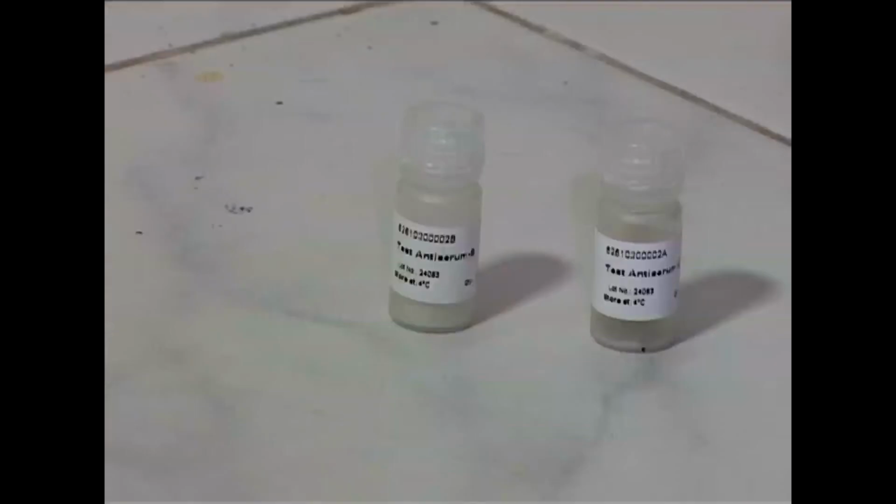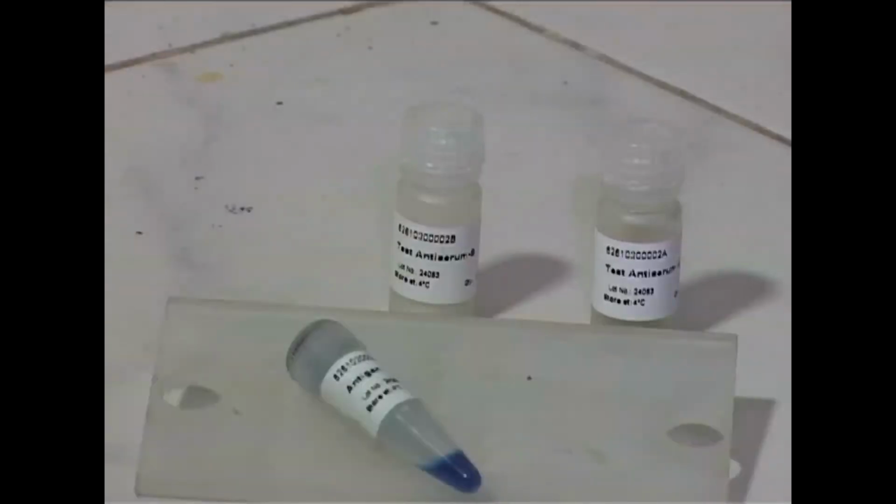Radial immunodiffusion is an immunoassay where antibody is trapped in an agarose gel matrix and then antigen is added in the middle of it in a well, and the antigen is allowed to move through the agarose gel. As the antigen moves through the agarose gel, its concentration will decrease, and when it reaches its own equivalence zone, it will form a precipitin line. Looking at the precipitin line, we can confirm that yes, that particular antigen is present. To perform the radial immunodiffusion assay, we need antiserum, antigen and agarose.